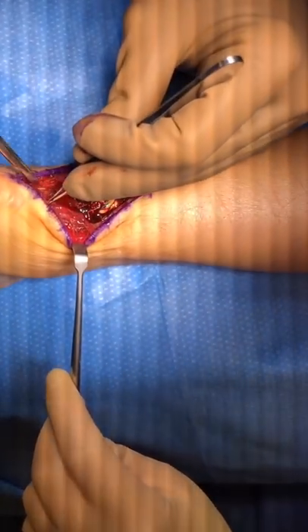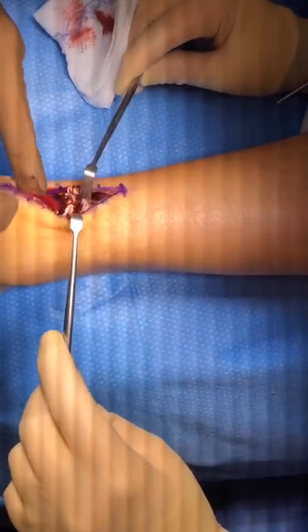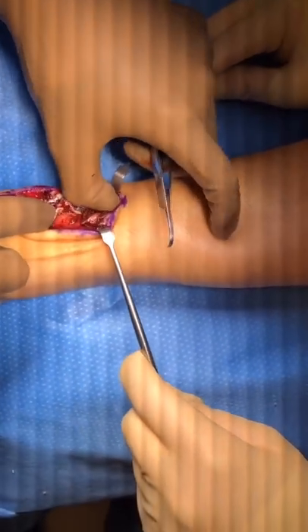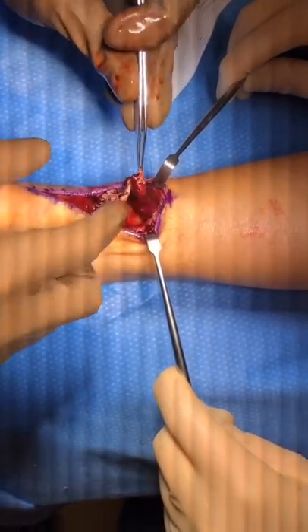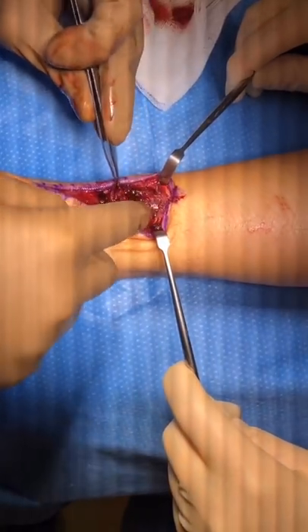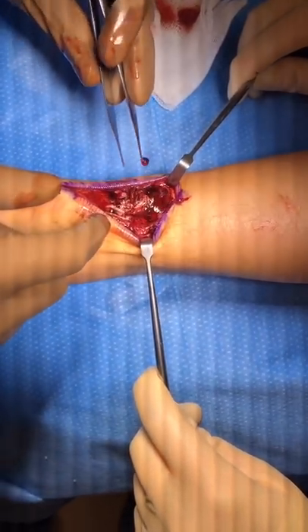Here you can see the obvious rupture of the Achilles tendon on both sides. What we will do is place what we call a Krakow stitch, which is a stitch that goes through the proximal segment and the distal segment, and then we will tie those together.